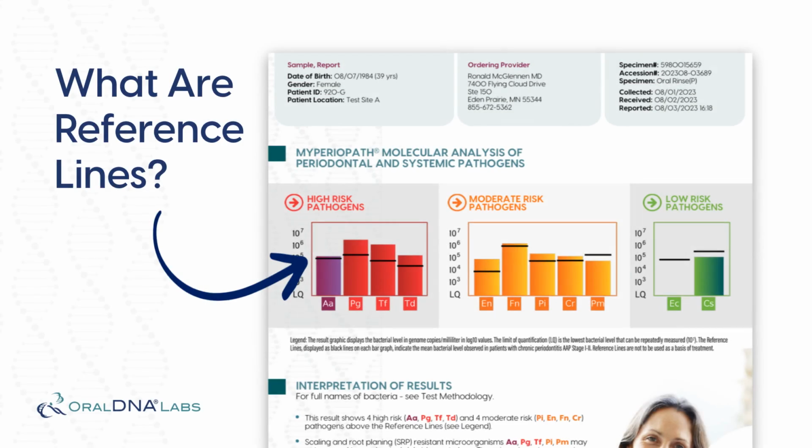In this video, we're going to explain what the black reference lines on the MyPeriopath report are, what they mean, and how they can be customized based on your practice's preferences.